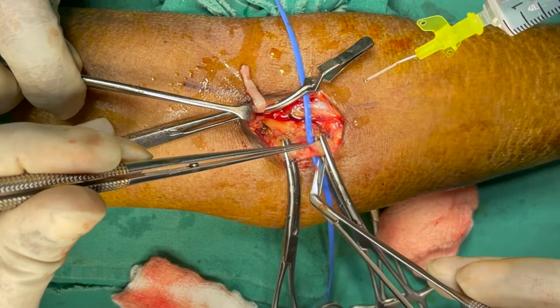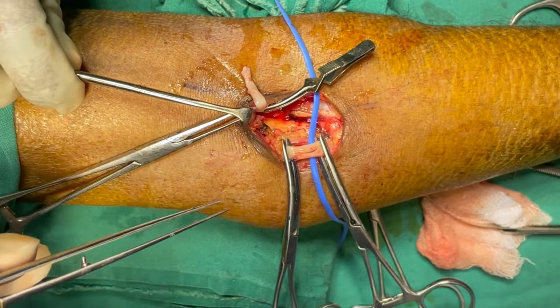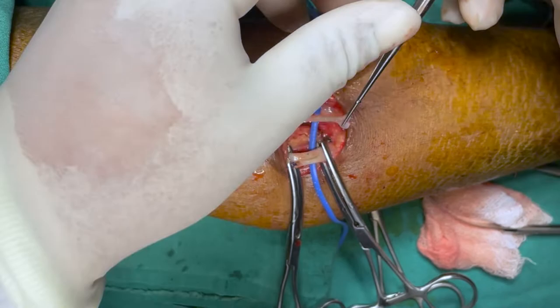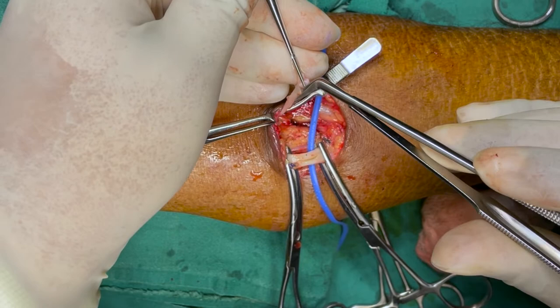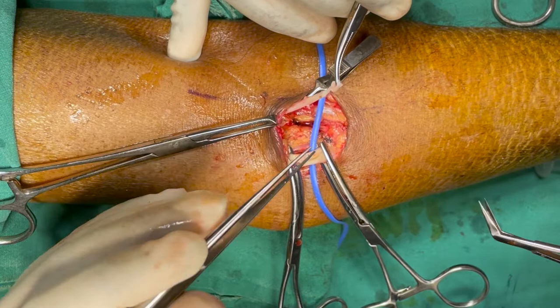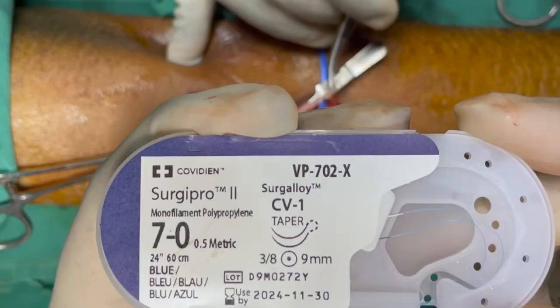The arteriotomy is then extended both forward and backward by cutting. Then the vein is prepared for the anastomosis. Here we are using 7-0 polypropylene for the anastomosis.